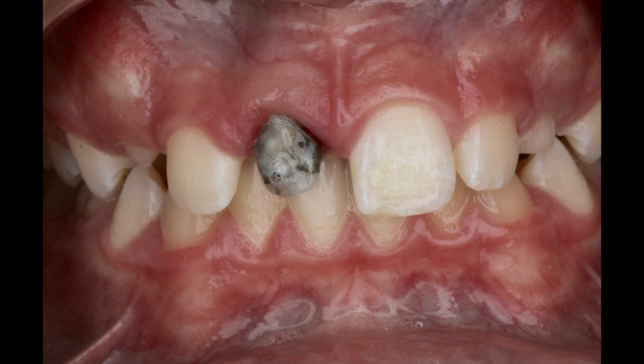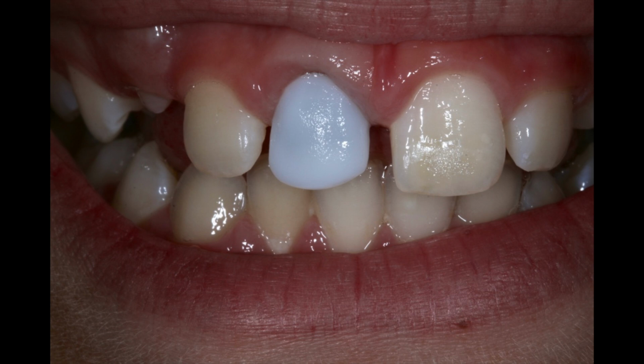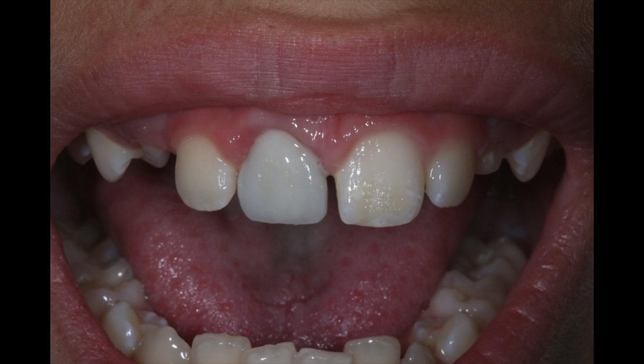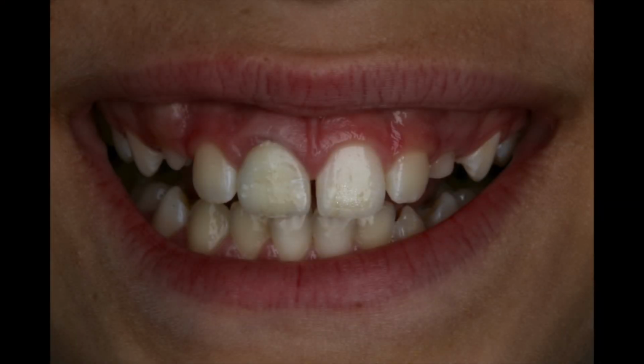After preparing the extruded root, several copings were fabricated in different materials to be able to mask the extremely dark discolored preparation. After a few try-ins, I was able to match the tooth color pretty closely. Considering the circumstances, the case turned out pretty satisfying. Touchdown, and Milo was able to smile.